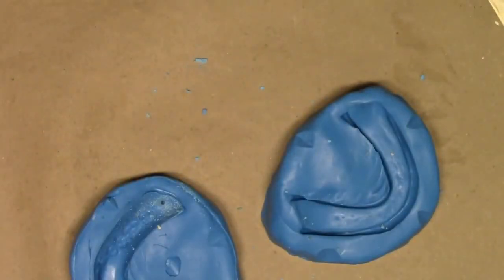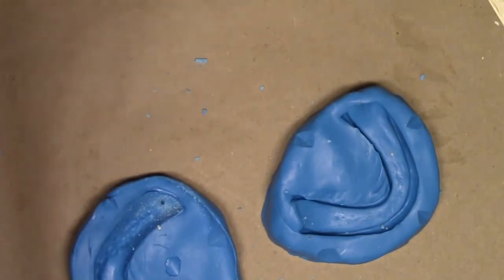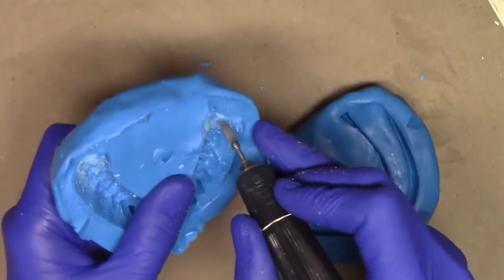Now, what I like to do is take a slightly larger burr and just enlarge that hole.